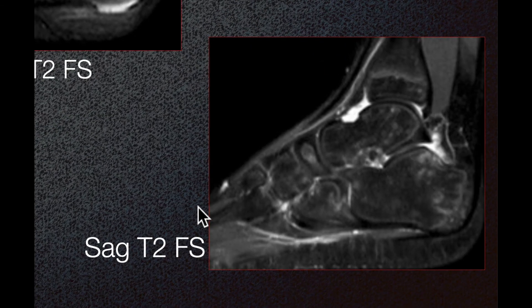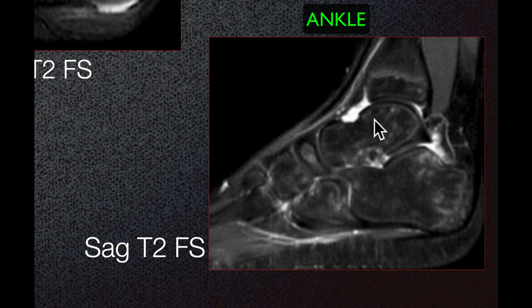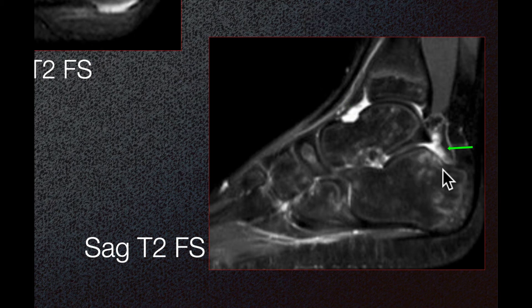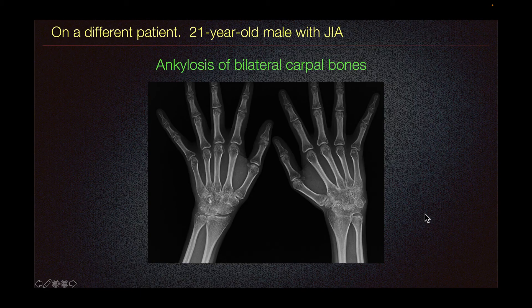On the ankle, the sagittal T2 fat-sat imaging demonstrates fluid in the anterior tibiotalar joint and the posterior recess of the posterior subtalar joint. Again, no erosion is detected on these images.